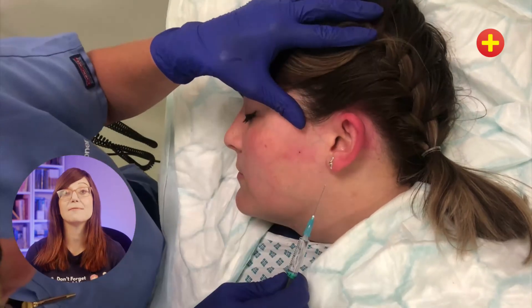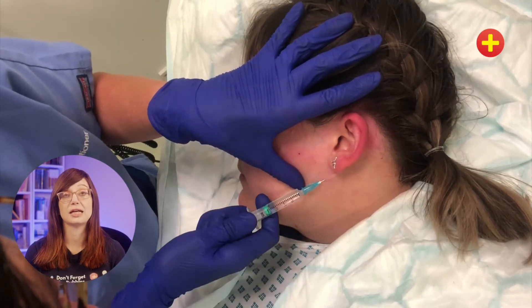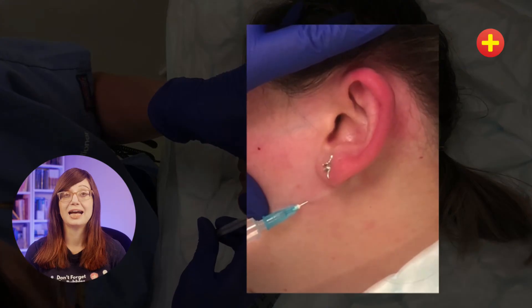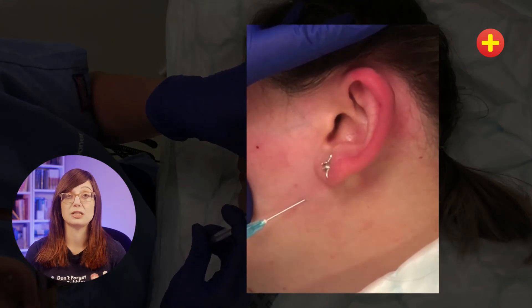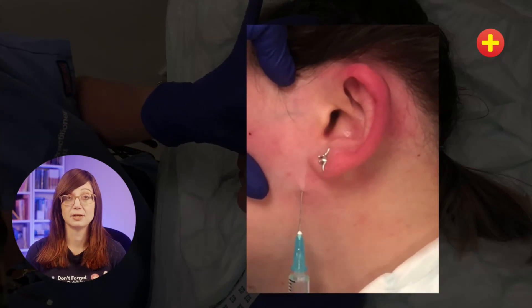Then you do the same on the inferior aspect. Insert the needle just below the ear, angle it posteriorly and inject the anaesthetic, then without withdrawing the needle from the skin angle it anteriorly and inject the local anaesthetic. By doing this you'll achieve good regional anaesthesia which will allow you to complete the procedure, which might be removing the earring from the ear lobe.